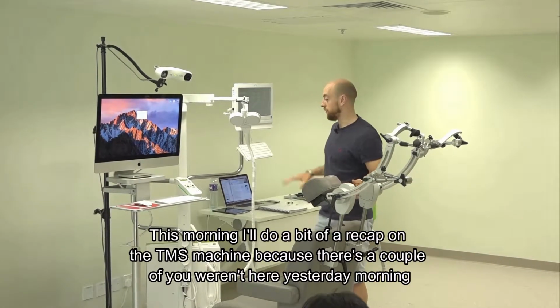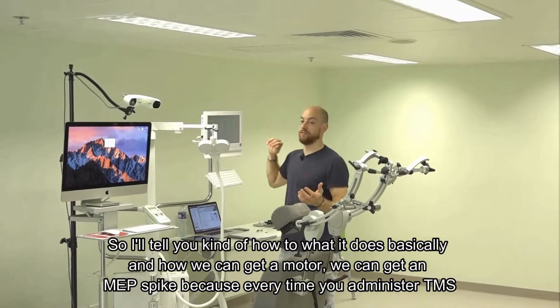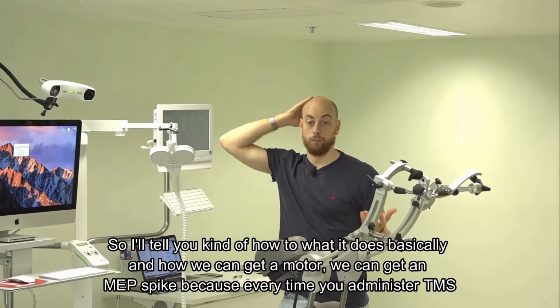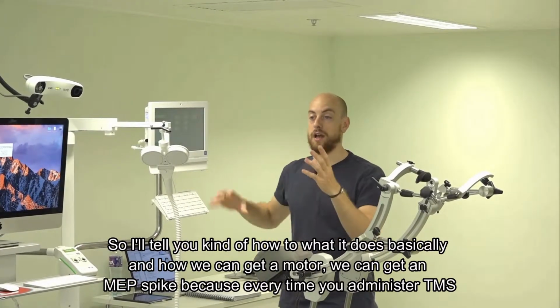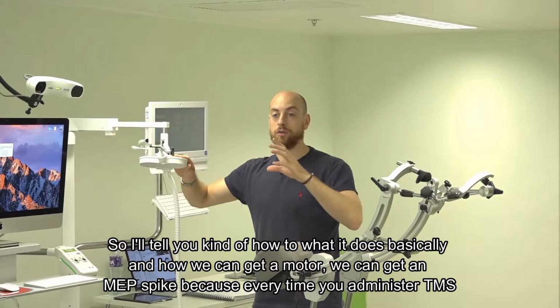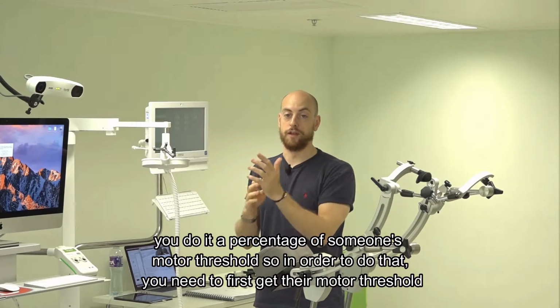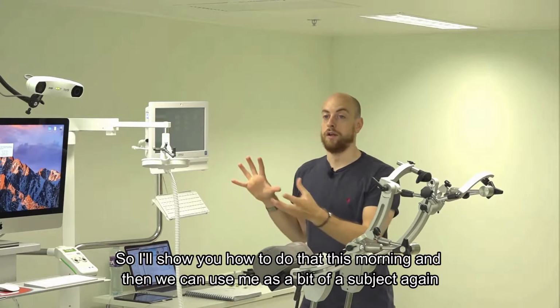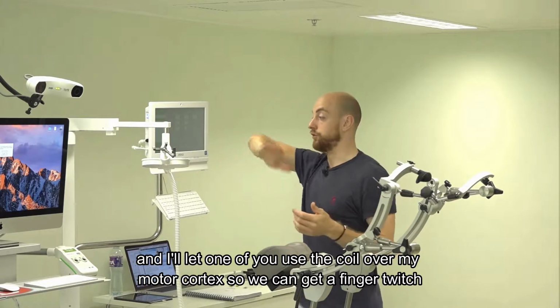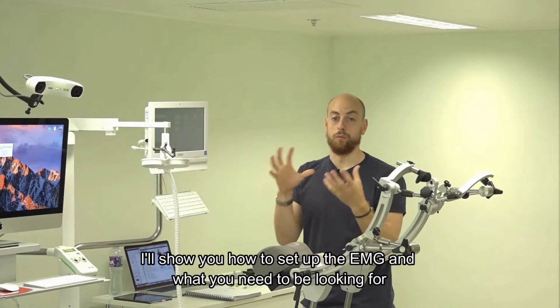So yeah, this morning I'll do a bit of a recap on the TMS machine because a couple of you weren't here yesterday morning. I'll tell you basically what it does, how we can get an MEP spike, because every time you administer rTMS, you do it at a percentage of someone's motor threshold. So in order to do that, you need to first get their motor threshold. I'll show you how to do that this morning, and then we can use me as a subject again, and I'll let one of you use the coil over my motor cortex so we can get a finger twitch. I'll show you how to set up the EMG and what you need to be looking for.